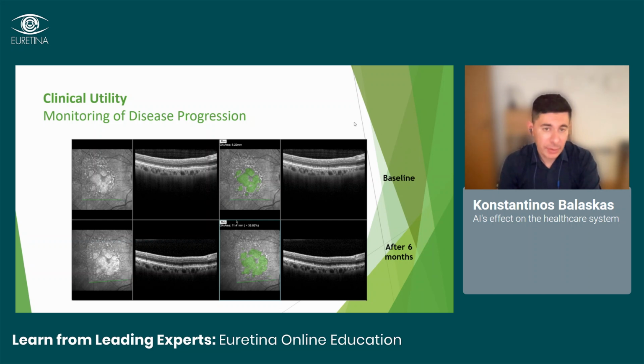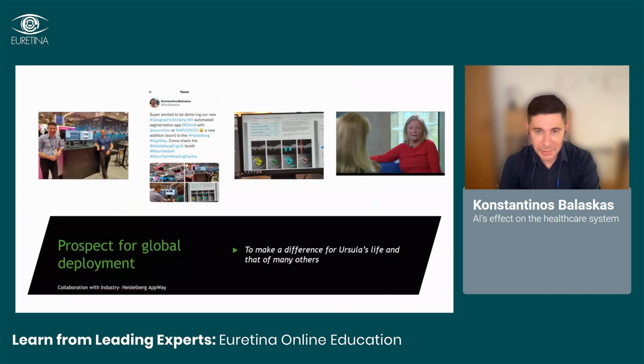The clinical application is evident here because it will be impossible, especially with monthly treatments that are likely to be the case, at least for the treatments that are now licensed, to detect the subtle changes in the size of the surface area without automated, accurate, reliable, repeatable quantification.